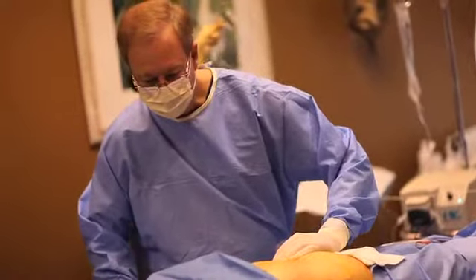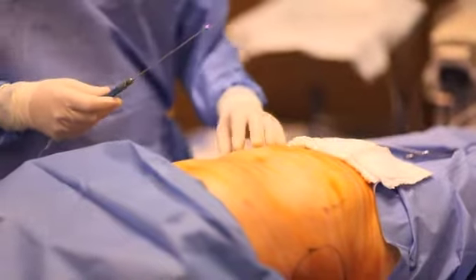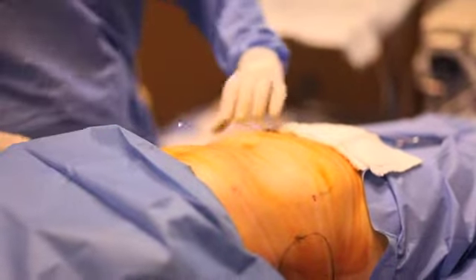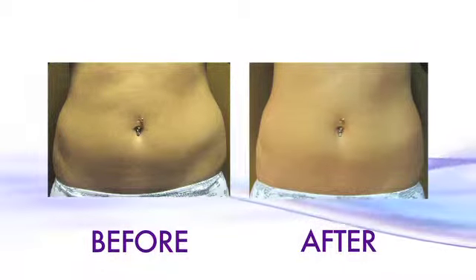Dr. Hunt is performing the new water-assisted liposuction called BodyJet. It requires less tumescent anesthesia, as this is a gentle way of removing unwanted fat to give you that perfect shape you have worked for with diet and exercise but have not yet been able to attain.